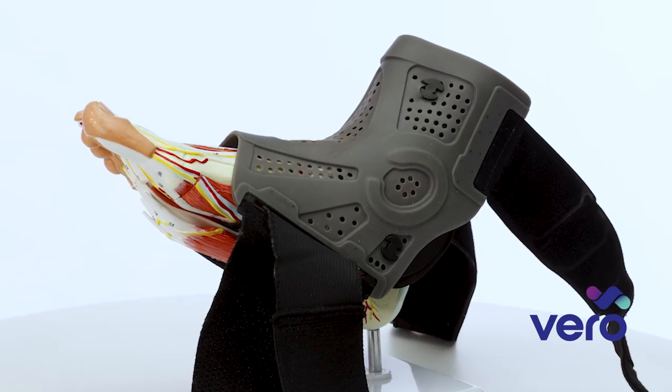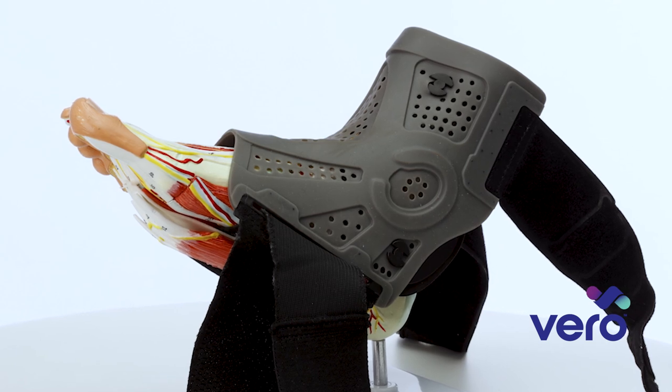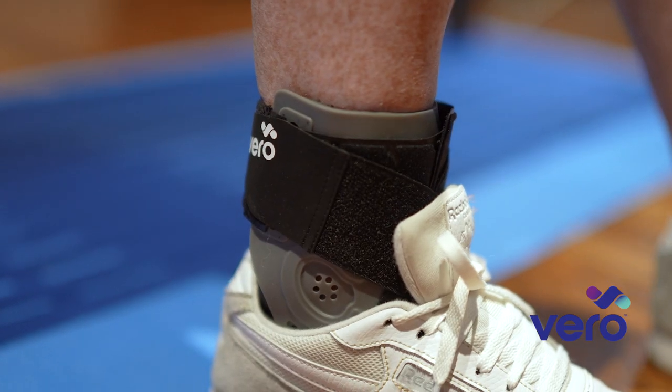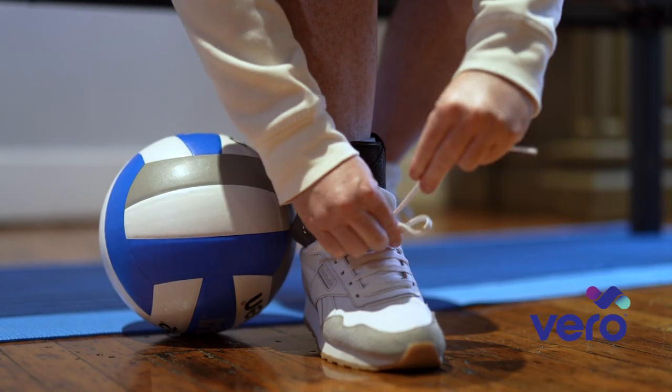If you look at the boot itself, you will notice the perforated areas that allow for breathability. Many braces do not account for airflow, and this can cause perspiration buildup and skin irritation. At the bottom of the brace, you can see it is very low profile, which allows the brace to be used with most athletic or work shoes.